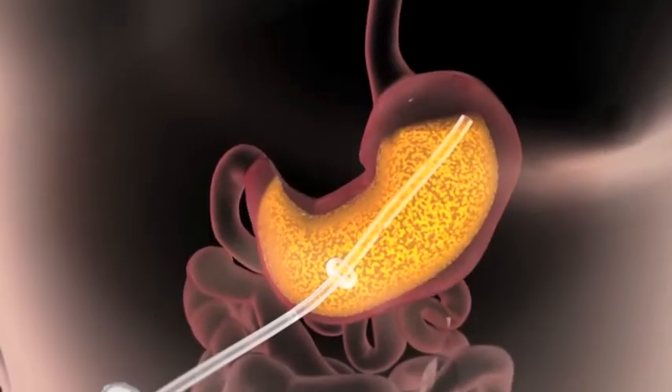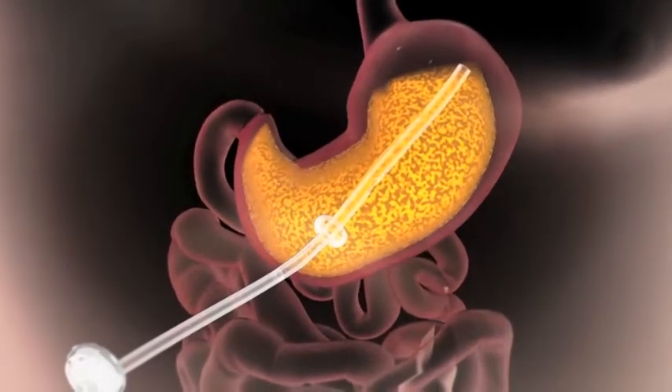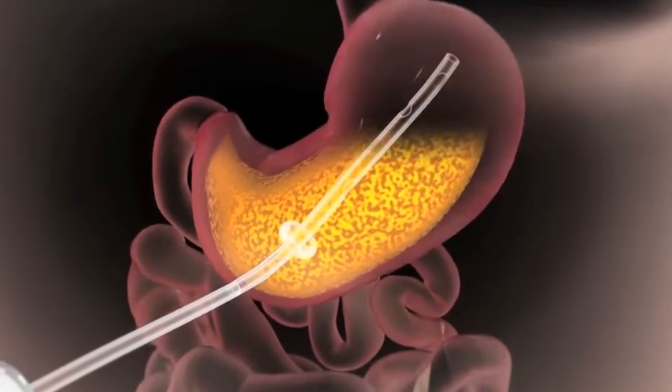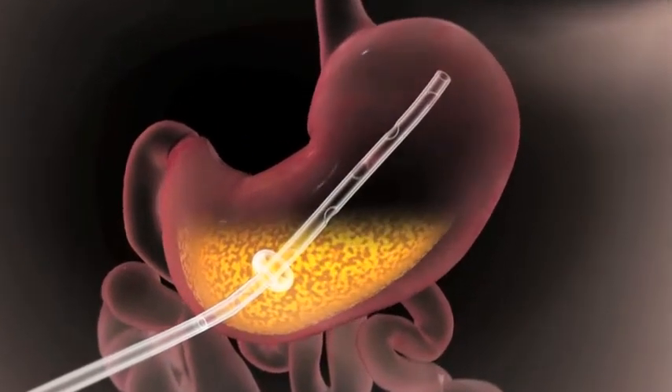After a meal, food travels to the stomach where it is temporarily stored and digestion begins. The Aspire Assist works by removing a portion of the food from the stomach through a tube before it is absorbed.